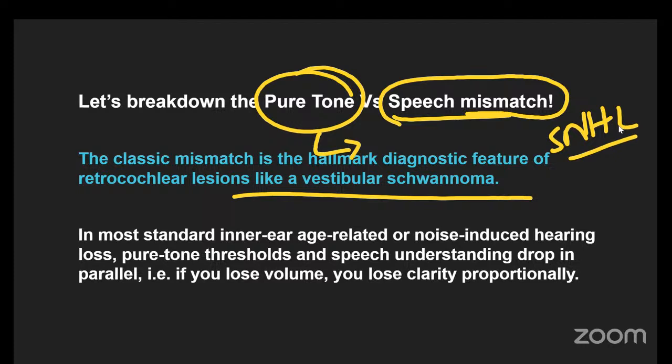Okay. Thank you. This is probably the most important concept you are going to take from this session. Have you ever heard that single beep, like a simple beep when you pick up the old intercoms or phones, or even when you call somebody and there's a single ring, right? A single pure tone. That is a single beep. Speech mismatch is when the patient is able to hear that beep, but the patient cannot understand the speech.